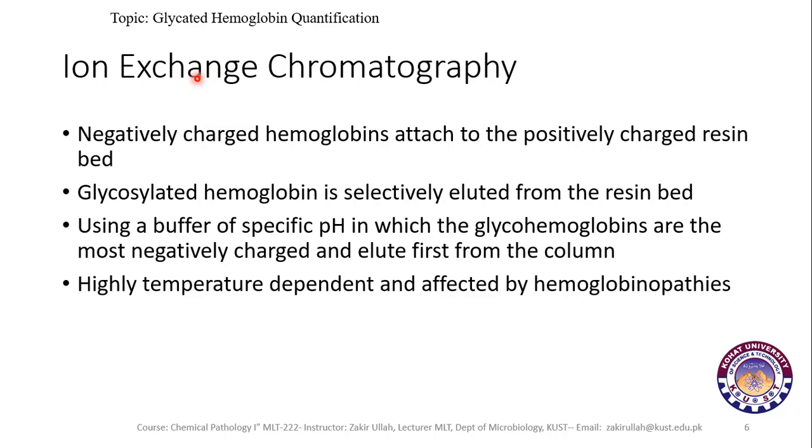The issue with this method is that it is highly temperature dependent, and a slight variation in the temperature can cause a disturbance, a decrease or increase in the result. Also, if there are other types of hemoglobin disorders or hemoglobinopathies, this ion exchange chromatography is disturbed by them.